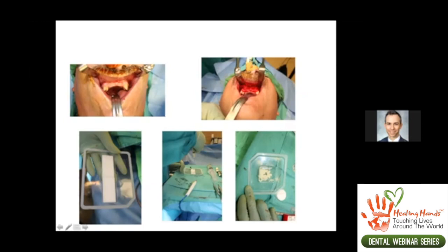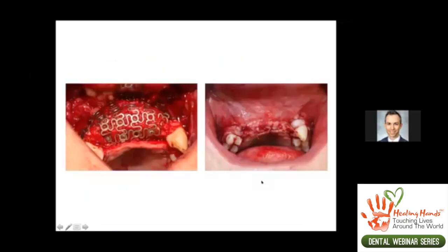And so this bone morphogenetic protein is reconstituted, and then it's dripped onto these collagen sponges. Then we cut the collagen sponges and mix them with the hydrated allograft bone, and we contain all this with the titanium mesh here. You can see, to avoid excessive resorption in this case. I don't think this is necessary in every case, but I chose to use it in this particular case because the soft tissue looked quite contracted, and I was worried about excessive bone graft resorption.